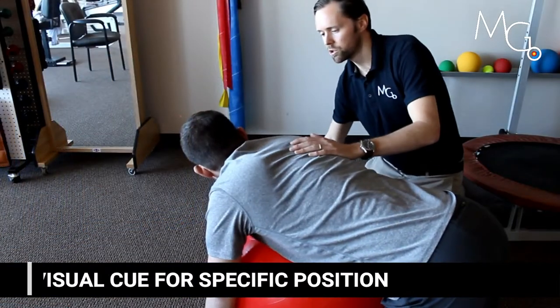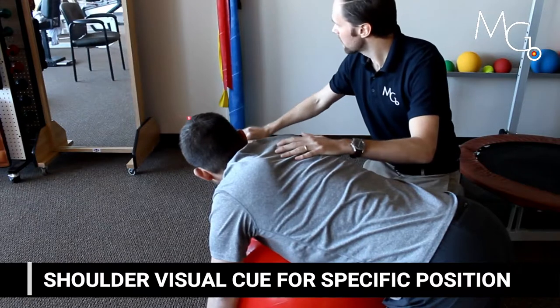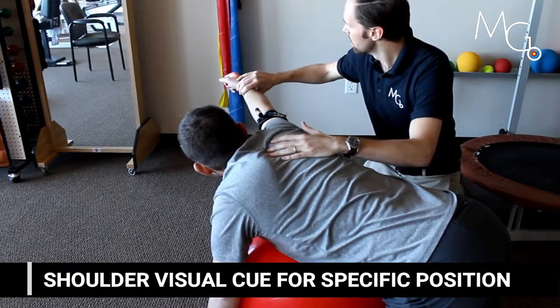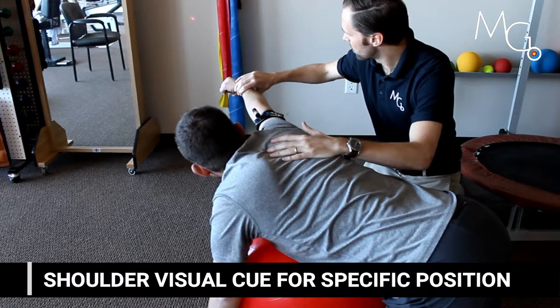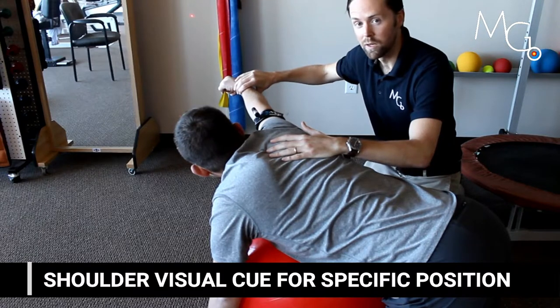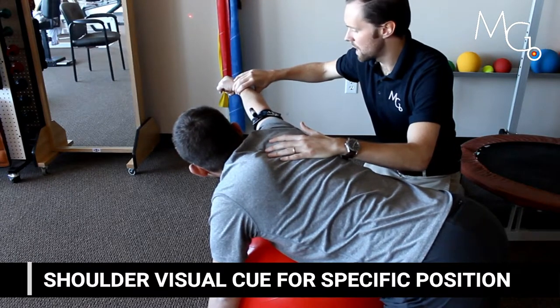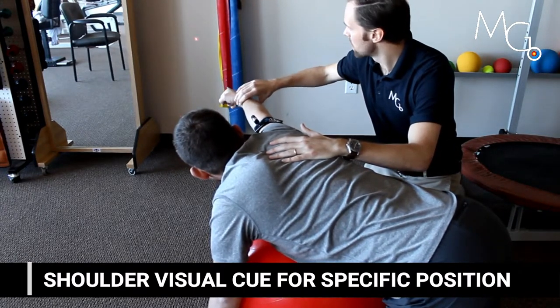Here's an example of using a visual cue on a standard exercise — just trying to help the patient figure out where their shoulder is in space and get back to that mark to perform an exercise in a specific position.